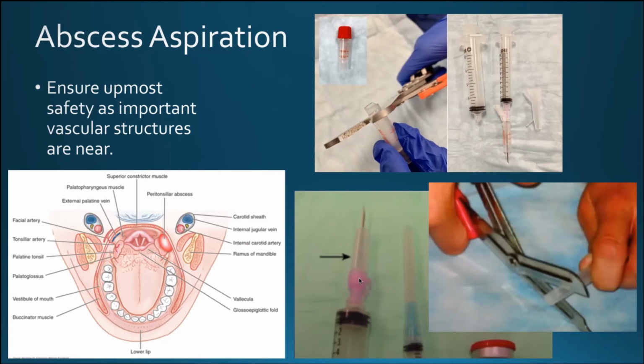There's another alternative approach, because some people say these caps are actually pretty hard, and sometimes when you cut them, they can be jagged, or there can be pieces hanging off a little bit, and some of them can fall off, with potential aspiration for the patients, or the jaggedness itself can be very uncomfortable. So an alternative approach is that you can grab one of these little pediatric vacutainers and cut off the cap, right?